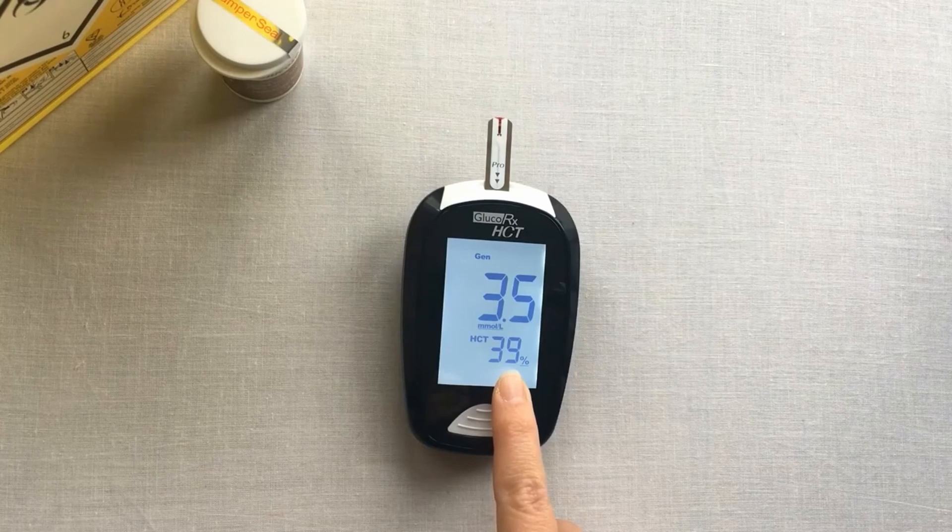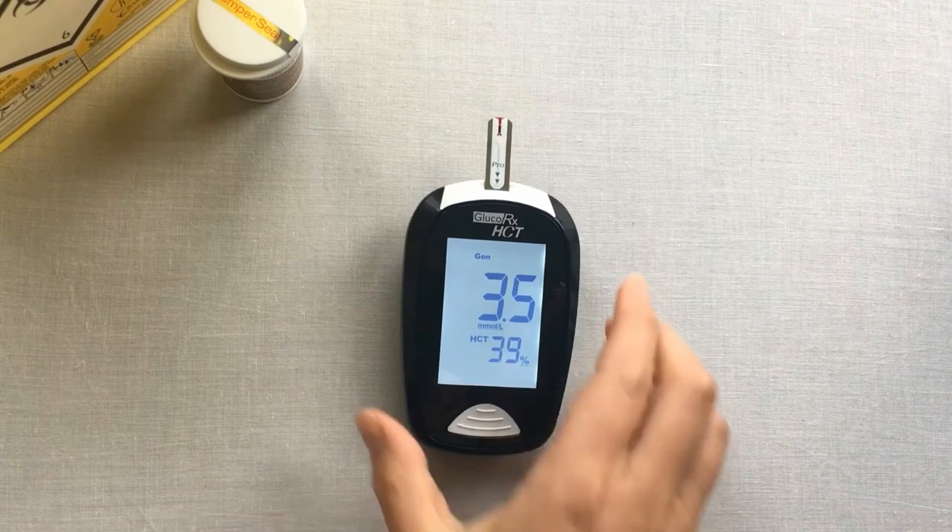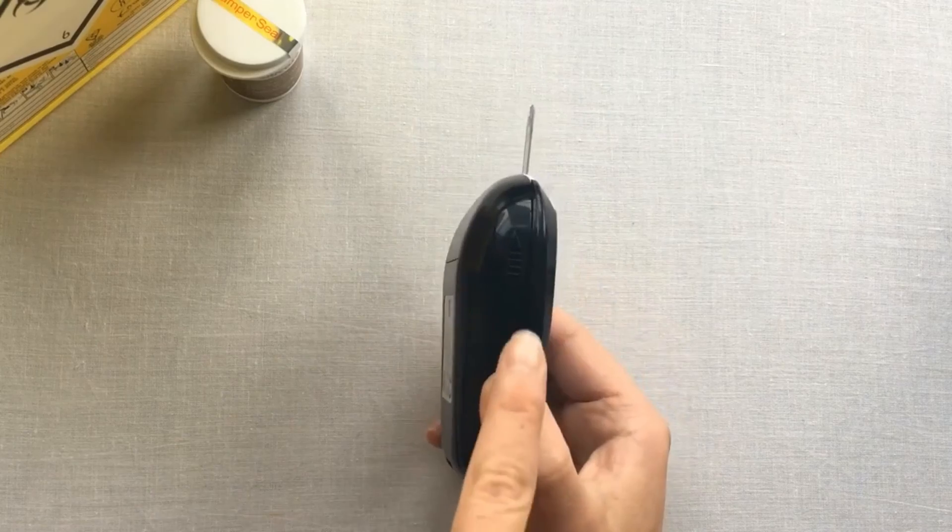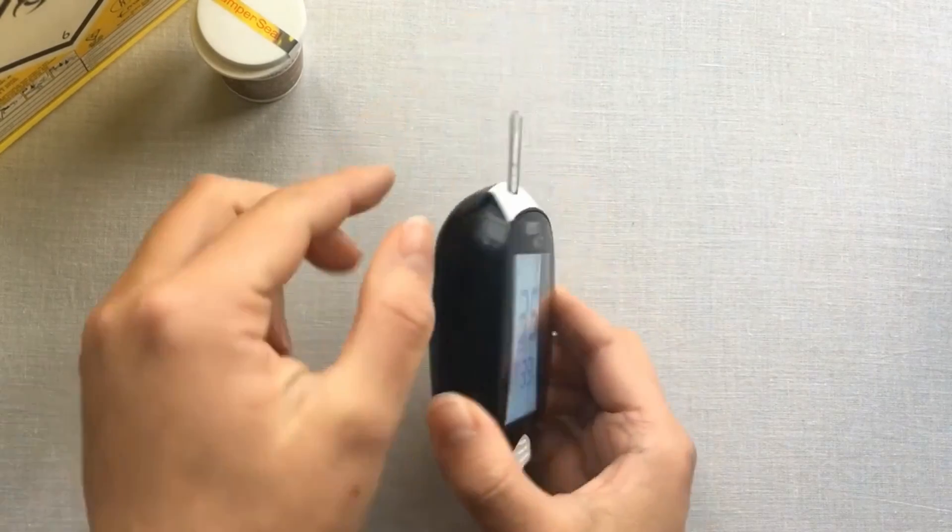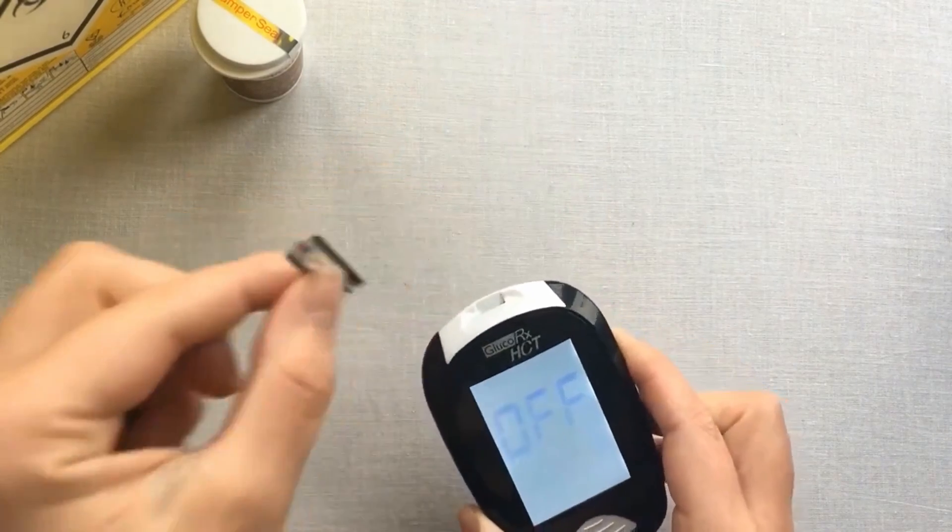You can either manually remove the test strip or you can use the strip ejector button. Please ensure you dispose of the strip and lancet into the sharps bin.